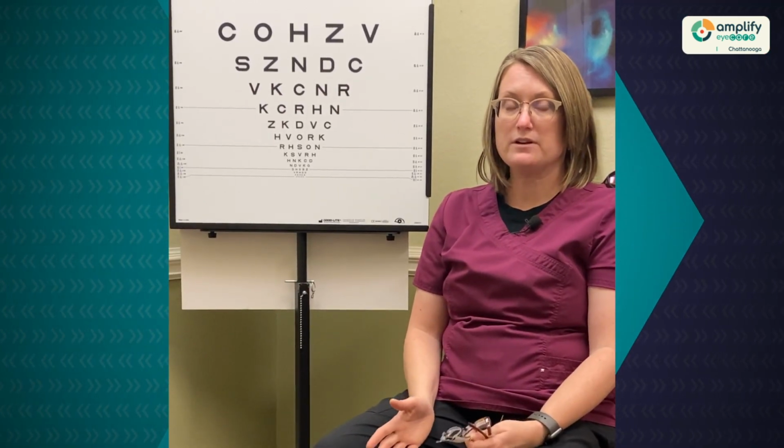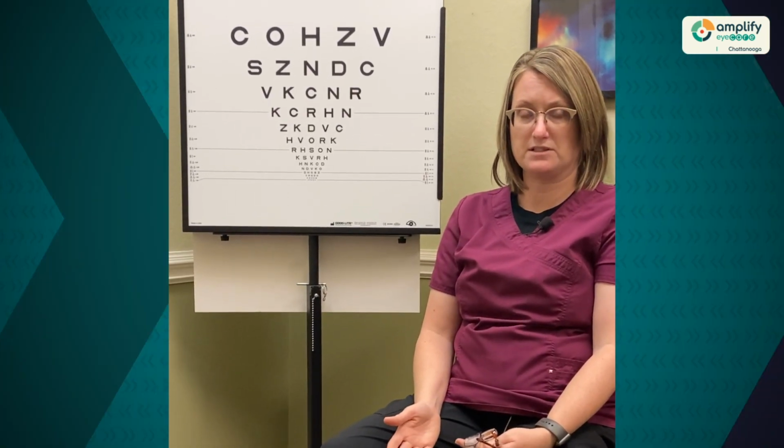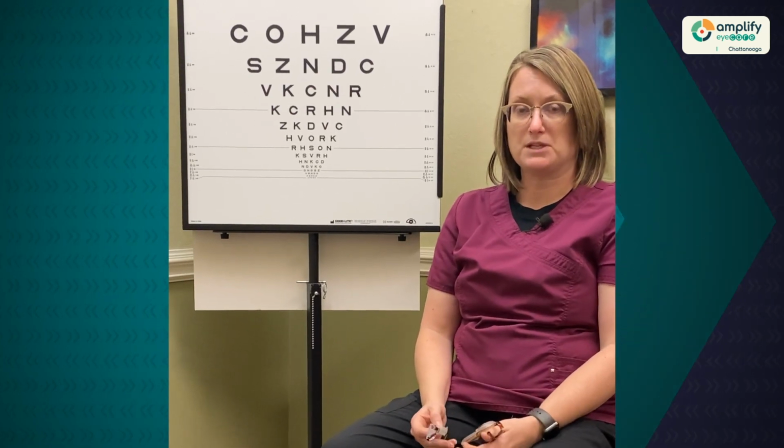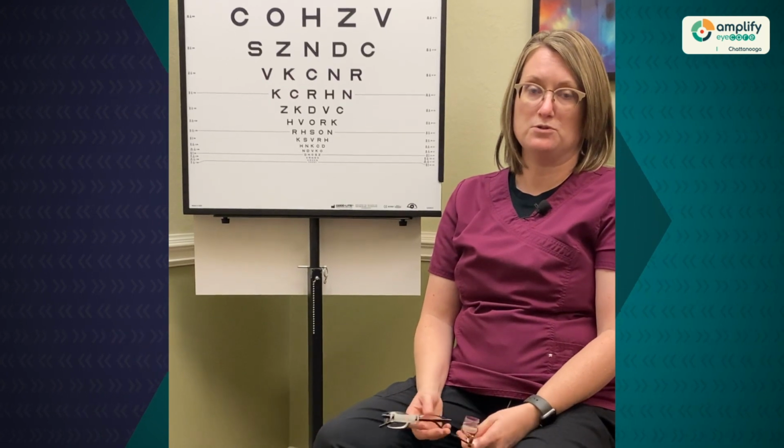So depending on what the patient's goals are, we then try to determine what optical devices will help meet those patient goals. So this is where the concept of things like prismatic readers, microscopes, or telescopes would come into consideration. Microscopes and prism readers are going to be used for up close, and telescopes are going to be used more for distance magnification. So when we talk about prism readers, what these are is they're higher power readers.